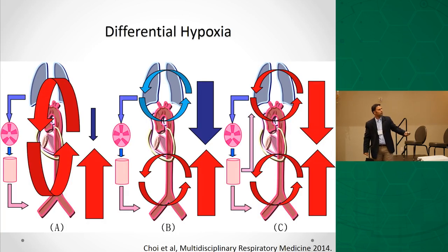All right, we'll come back here, sorry. So you have now two opposing forces. One is your native heart circulation, that is anterograde, forward, and now you have an ECMO flow which is coming from below, retrograde. So now the battle is whoever is stronger wins the battle.